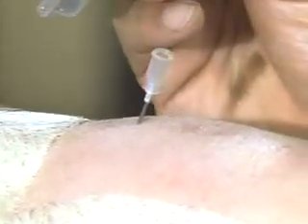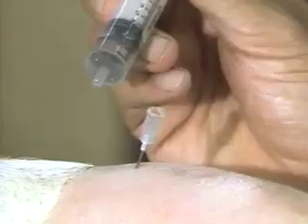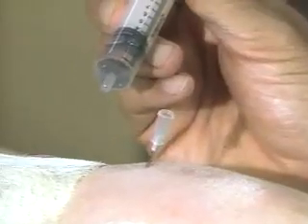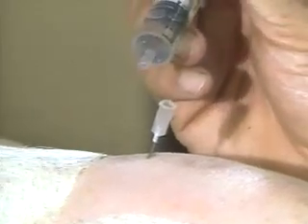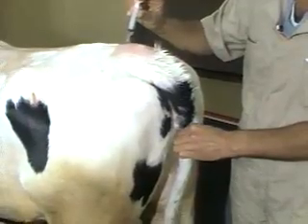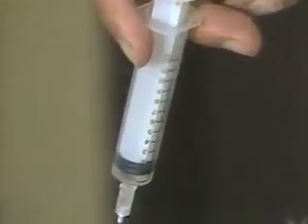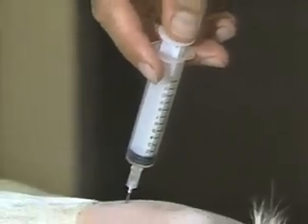As for the anesthetic, I'm using lidocaine, and I'm measuring the dose to be approximately one-half cc per hundred pounds of body weight. So if this heifer weighs about 600 pounds, we're going to give about three cc — that will be just enough to get anesthesia to the perineum; we'll not put this cow down. At that point, attach the needle, stay in the same site, and make an injection. The plunger should almost fall in. One other test: when pushing on the plunger of a disposable syringe, you shouldn't blanch your thumbnail — if you do, you're not in the right spot. There it went in. Then you withdraw the needle.